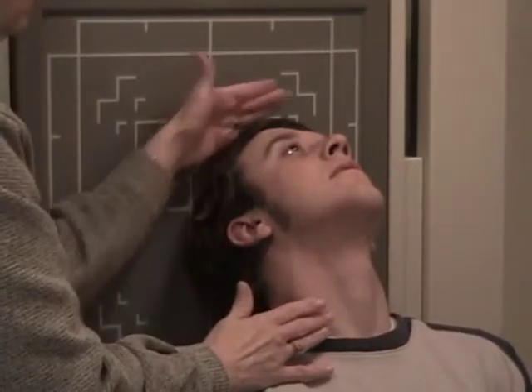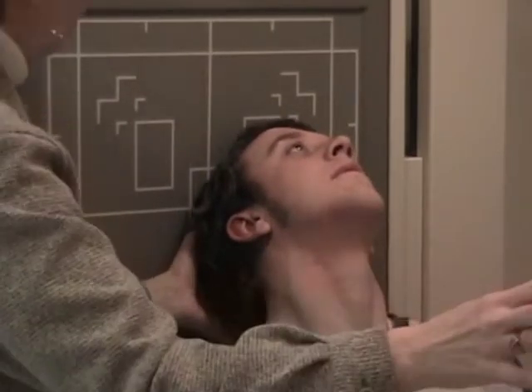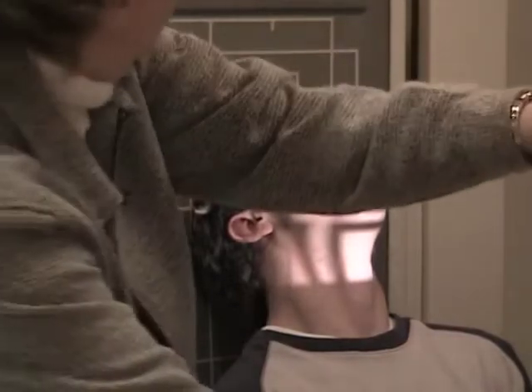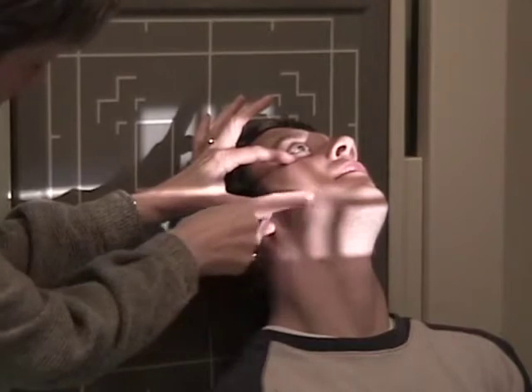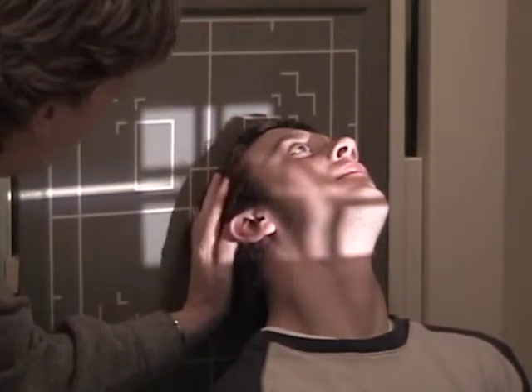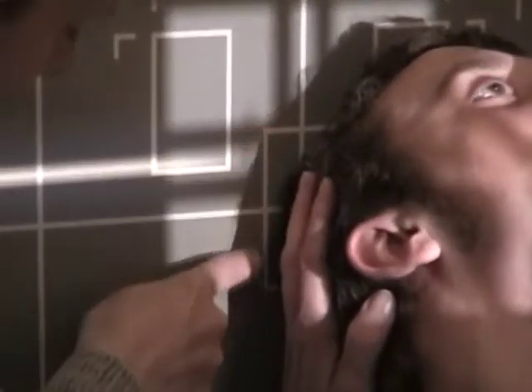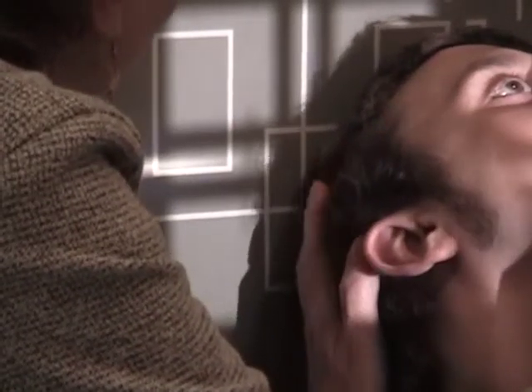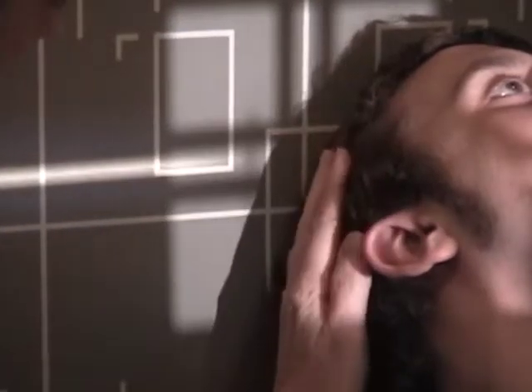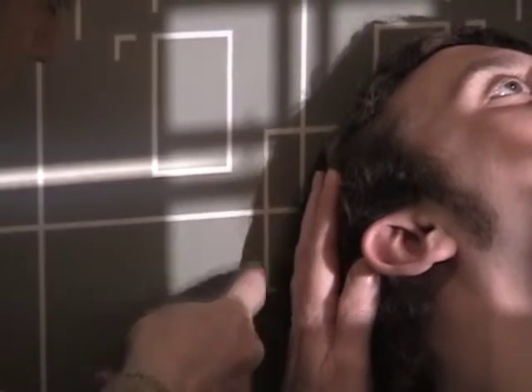I took the vertex, sent it that way 15 degrees, and his MSP is turned. I'm going to come right down through the zygoma. Here's the zygoma. You can see the centering coming right down through the center there. And I'm going to try to get rid of hair shadow here. We're going to focus on the board. And the zygoma, the process will be projected right here. Let's see. There we go. You're going to see a little shadow come out. If he didn't have hair, you would see just a little curve here.